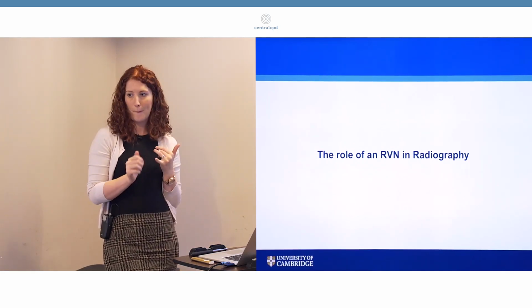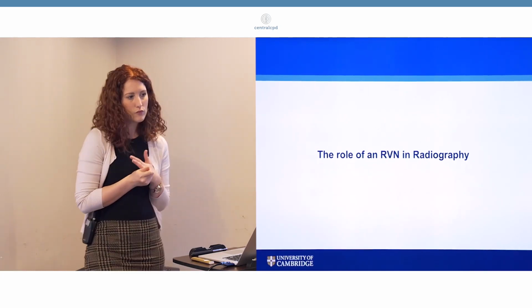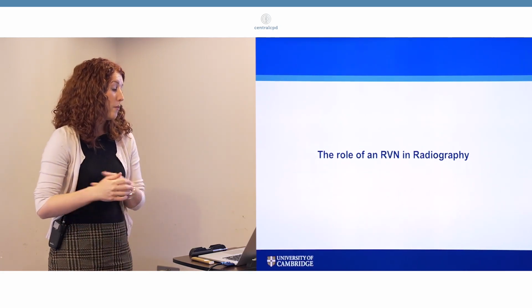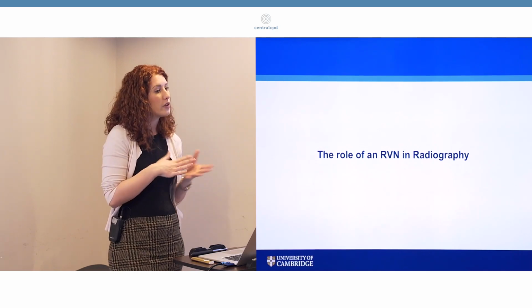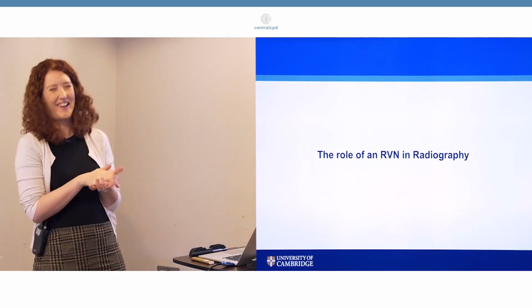Or know the landmarks and where you're positioning. Yeah, definitely. So know how to position correctly and be confident with your anatomy. What about when you've taken the x-ray, then what? Are you going to be the one to look at the image, or is it someone else that comes in and looks at your images? The vet comes in. Okay. Yeah.